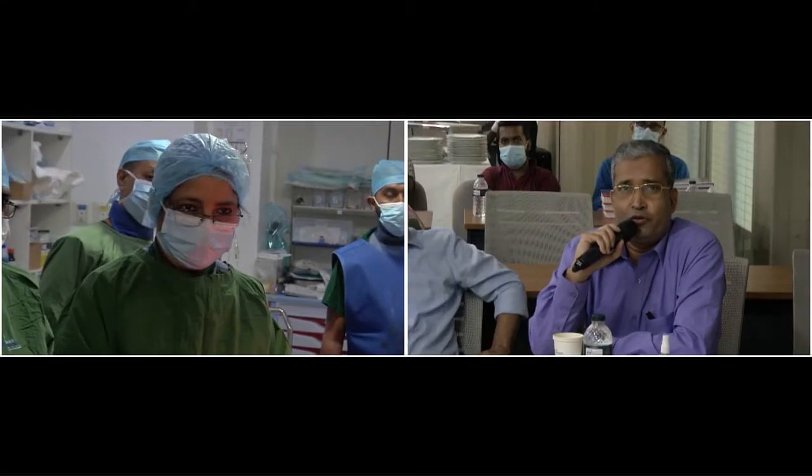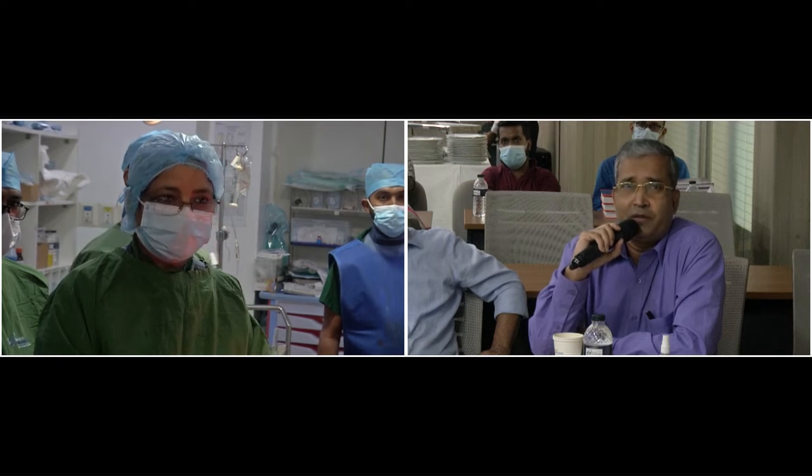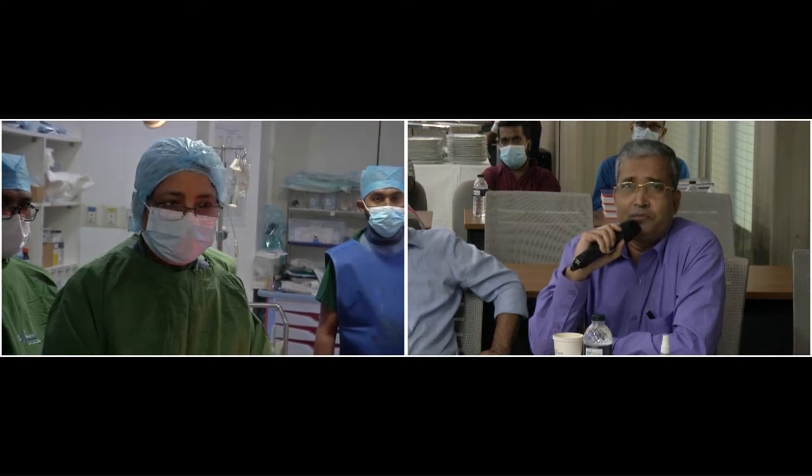Echo showed inferior rim was 12 millimeter. Yeah. I think it's good enough. Yes. And superior rim was 7.5. So yeah. This is a small child.